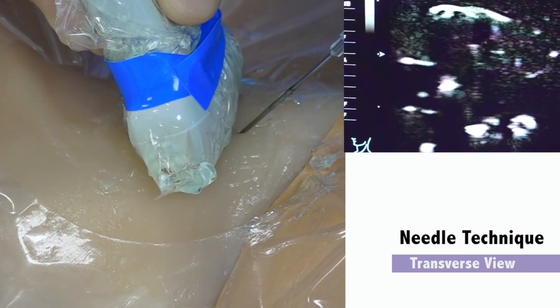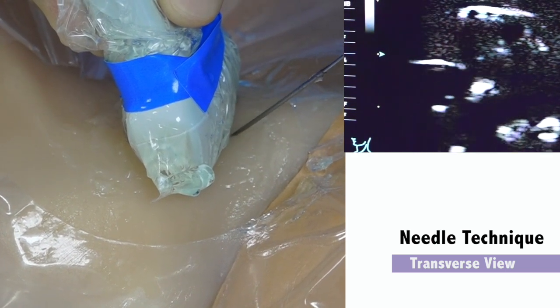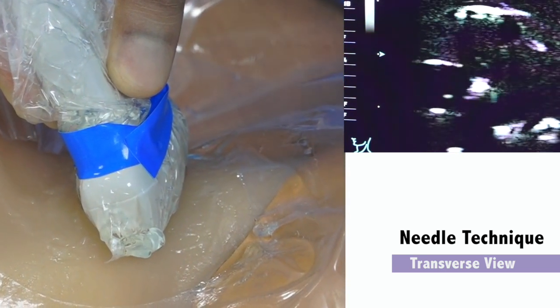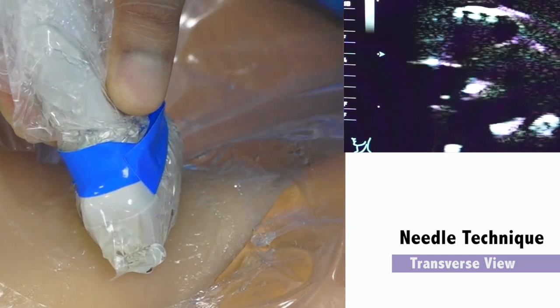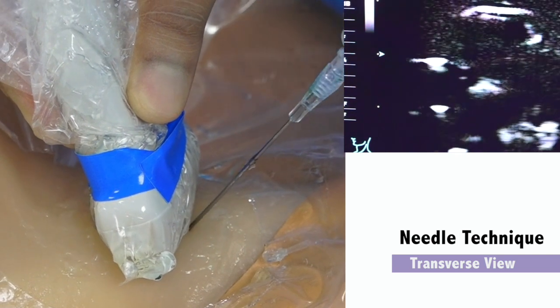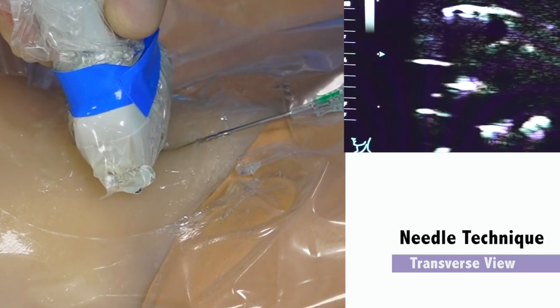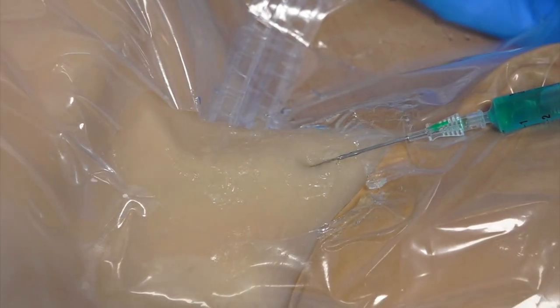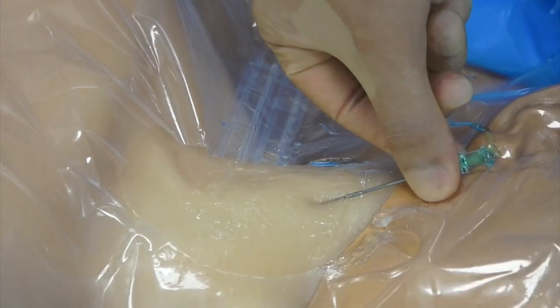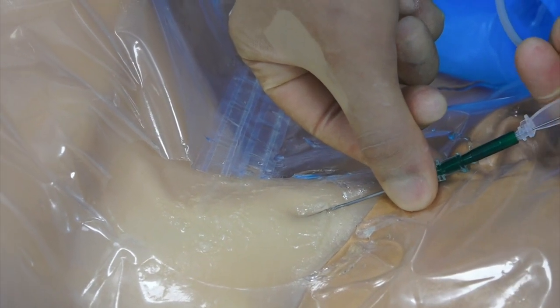Once the needle punctures the skin, a vacuum is made by aspirating the syringe and that vacuum is maintained by continuing to aspirate. If the tip of the needle appears to be deep, it is likely that the tip is no longer visualized and is deep to the internal jugular vein. This can be rectified by tilting the ultrasound probe to visualize the tip, or by slowly withdrawing the needle towards the skin. The internal jugular vein is often encountered on the way back. When the vein is encountered, a loss of resistance will be felt and blood will be aspirated in the syringe. Remove the syringe and confirm the blood is venous, i.e. non-pulsatile.